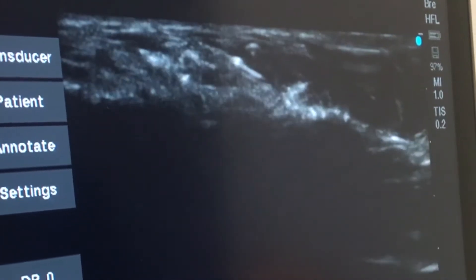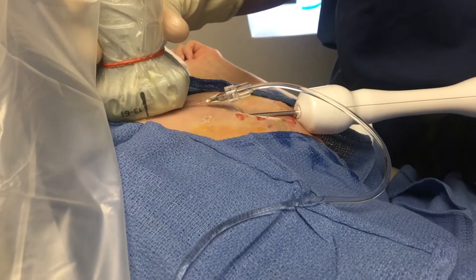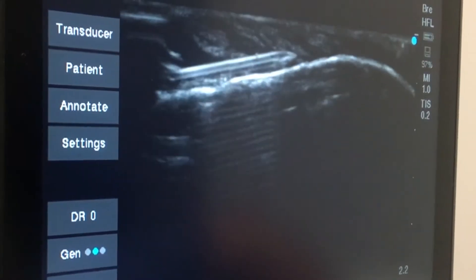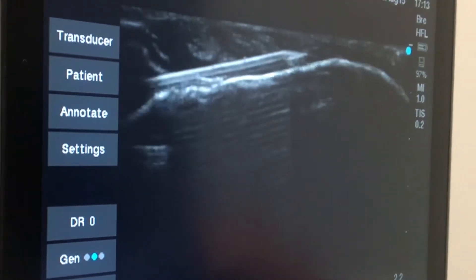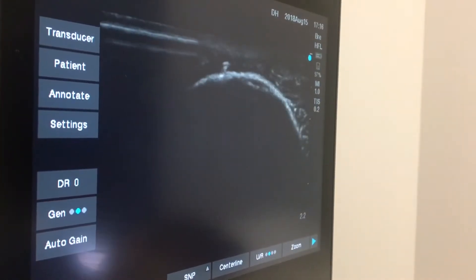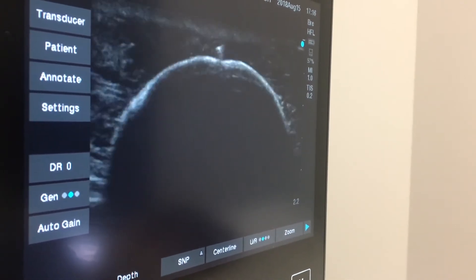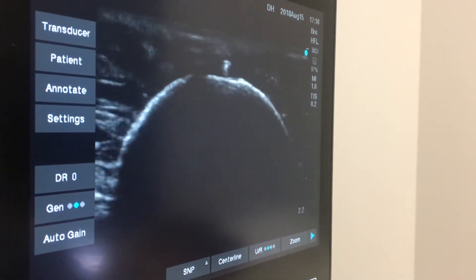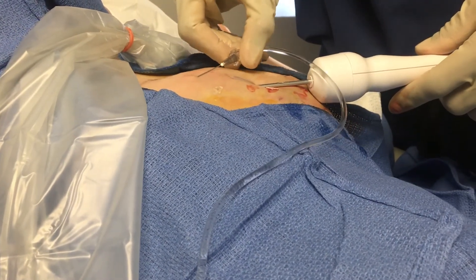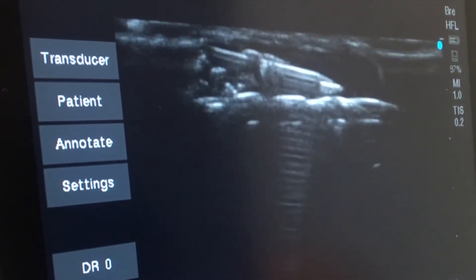The ice ball has begun to grow much larger and is now approaching the skin, so it's time to inject saline to protect the overlying skin. Here you see the dark ice ball below and the saline-containing needle entering the left side of the image to inject saline between the skin and the ice ball. At a different angle you see the saline-containing needle appearing as a white dot at the very top of the round ice ball. Now the needle position is adjusted to inject saline into a different area around the ice ball, and you actually see the ice ball move away from the skin as the saline is injected between the two.